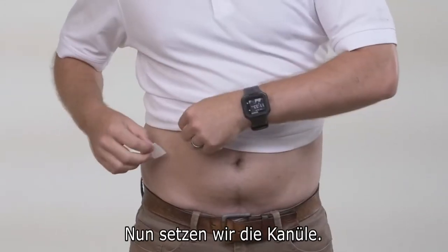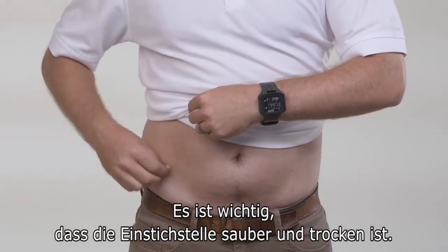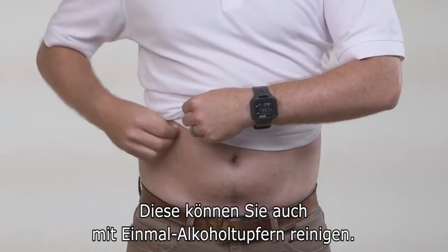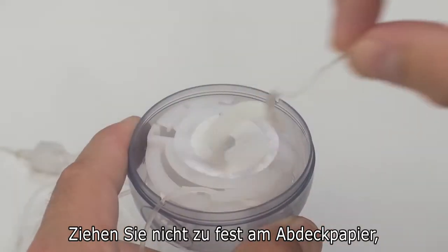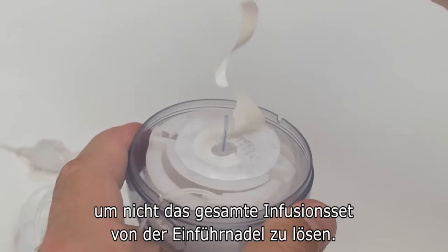Now it's time to insert the cannula. It's important that the area is clean and dry before proceeding. You can also wipe the area with an alcohol swab or an IV prep pad. Next, gently pull off the swirly paper backing on the adhesive. Be careful not to pull the adhesive paper too hard, as you could accidentally remove the infusion set from the introducer needle.